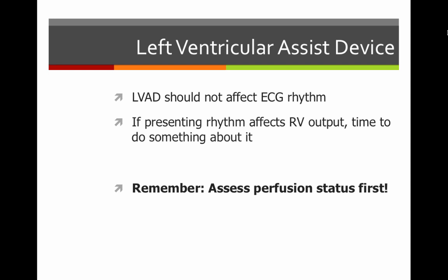On our ECG side of things, you put them on the heart monitor. The LVAD should not affect the rhythm that you see on the monitor. They may be in a sinus rhythm, they may be in an AFib, a flutter, they may be in a ventricular rhythm, might be in a junctional rhythm. The LVAD itself is not going to affect the ECG rhythm. But if the rhythm is affecting right ventricular output, we need to do something about it.